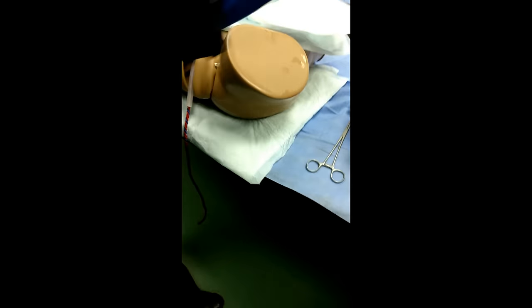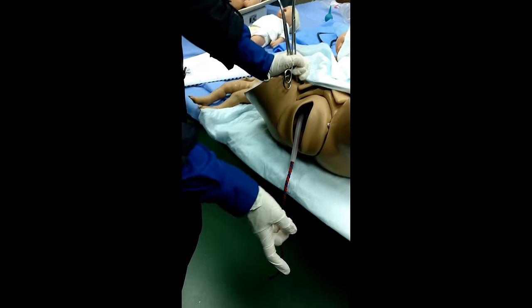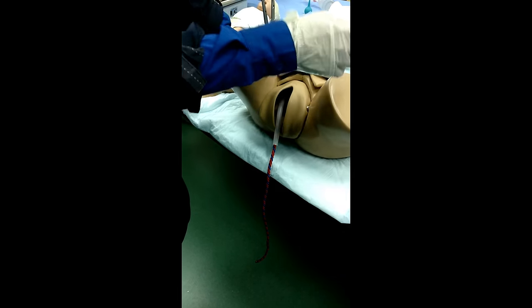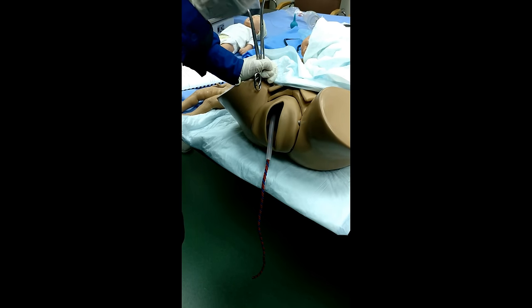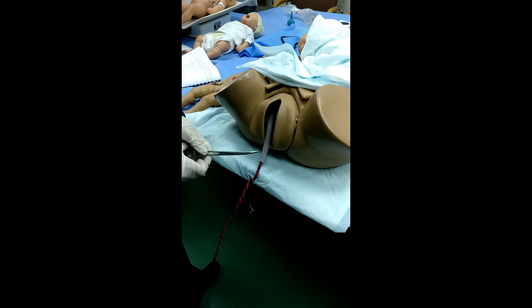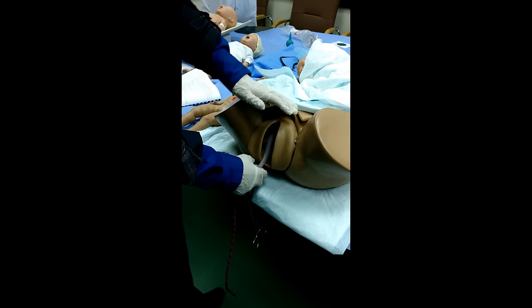What's the third period of labor? Immediately after labor, we introduce 10 units of oxytocin. You take the syringe, you take an alcohol pad, and you simulate that you introduce, and tell us, 10 units of oxytocin intramuscularly. After that will be clamping and cutting of umbilical cord. You just clamp it.